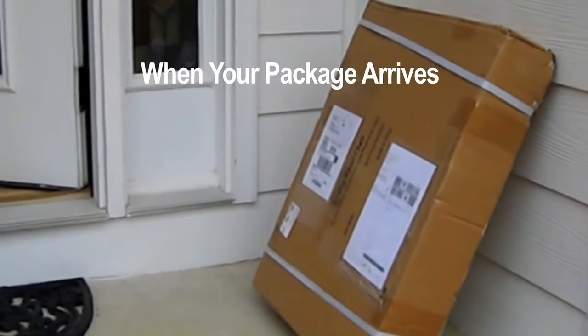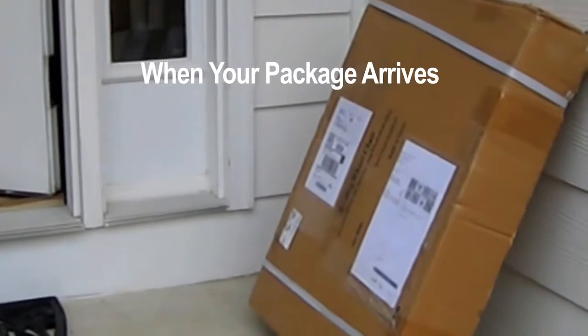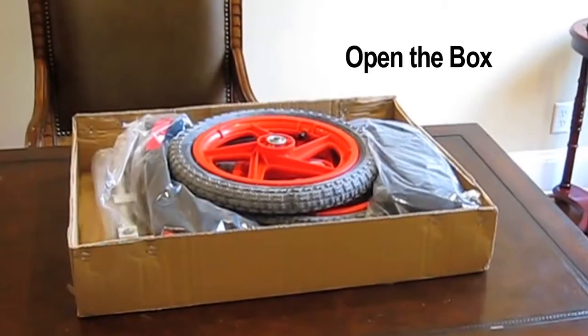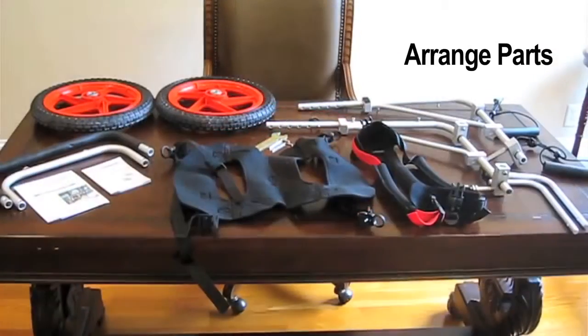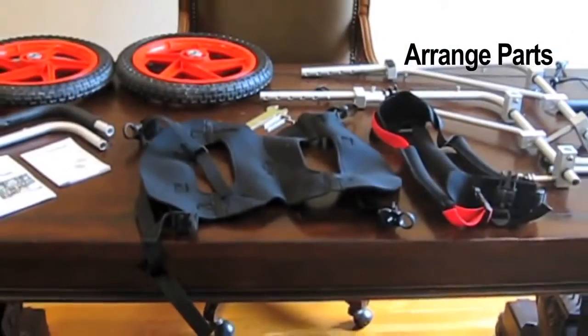Today we received our Best Friend Mobility large dog wheelchair and we're going to show you how to assemble it and fit it up to the dog. First, open the box and take all the parts out. Now you can see that we have all the pieces laid out so that we can easily identify them.